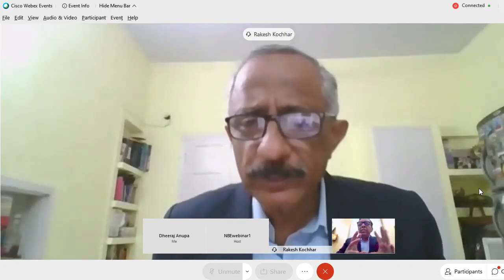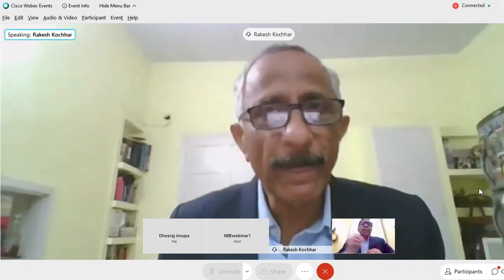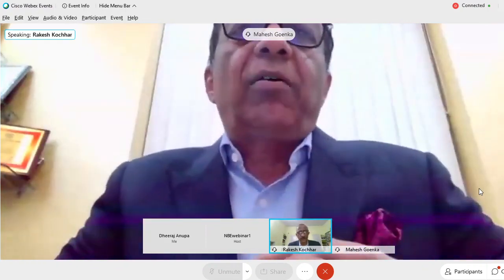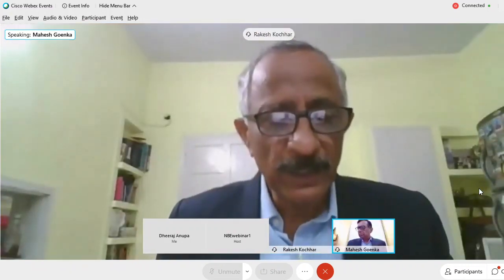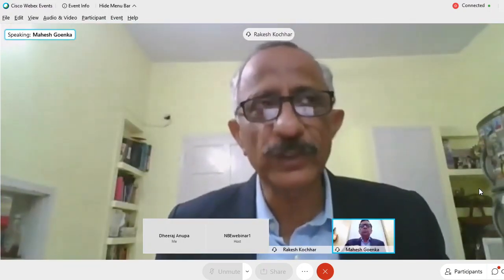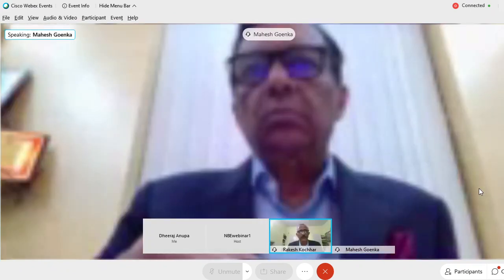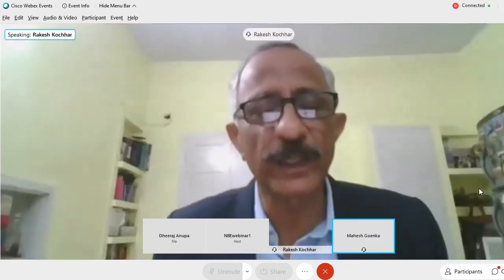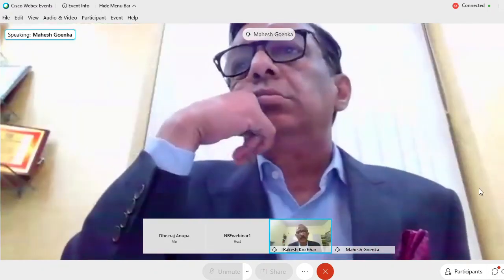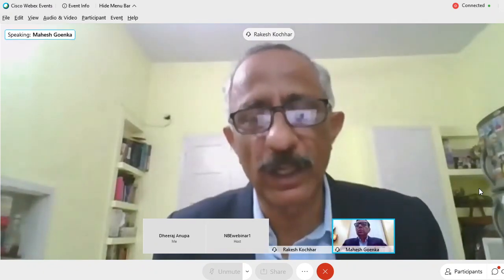So there's a question on how do we actually measure the thickness? I mean, is it all approximation or do you actually use a scale? Measure what? Thickness of any fold, or when you say the thickened fold or the height, do you use a biopsy forceps to find out what the measurements are, or it's just an eye observation? It becomes very subjective generally, but one must distend that part of the bowel, whether esophagus or stomach or duodenum, because a lot of folds in the stomach will get effaced if you distend it well. And that is one way of differentiating small varices from folds in the esophagus at times. So distension, and yes, if you have to measure, actually you must use a biopsy forceps, but otherwise we just give an empirical impression of thickened folds or normal. But this is after full distension of that part of the lumen.